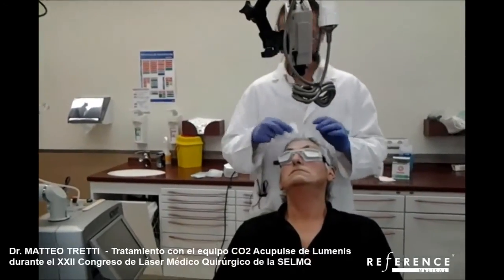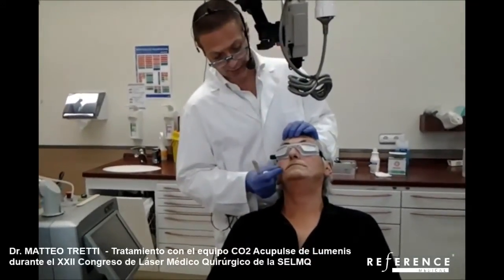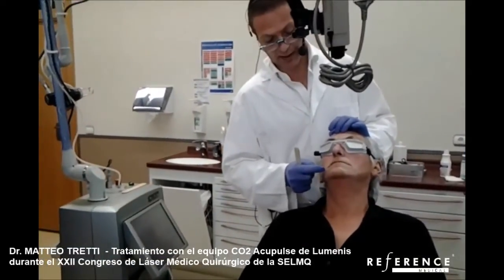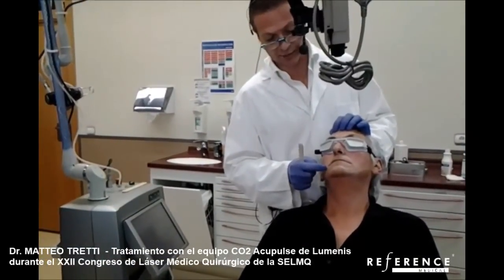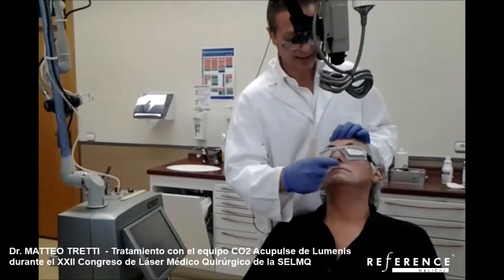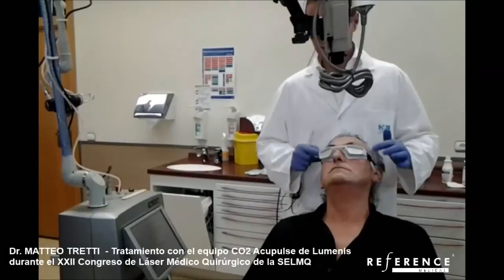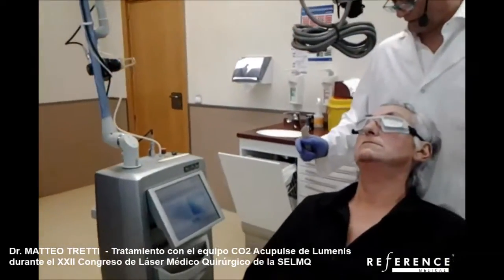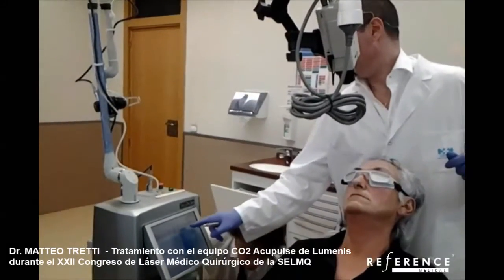The plan is to start treating the base of the wrinkles, then do a more aggressive treatment around the mouth area, and more superficial treatments on the forehead.